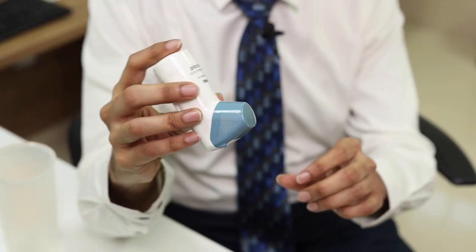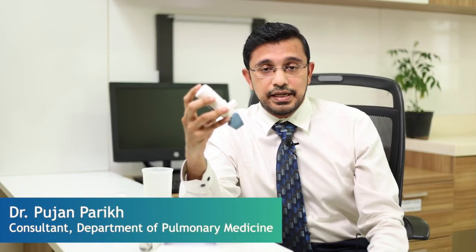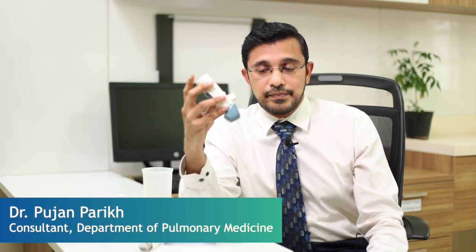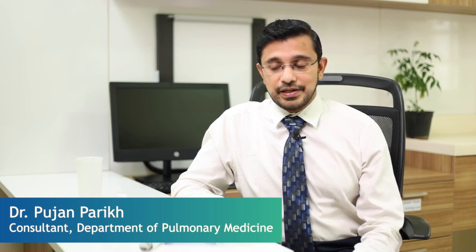Now there are other types of MDI devices which we have. This is called a synchro breath, where the patient doesn't have to press the inhaler. The patient just has to keep this inhaler in the mouth and take a long deep breath, so that the device will automatically release the medicine. Now the second drug delivery method is the DPI.